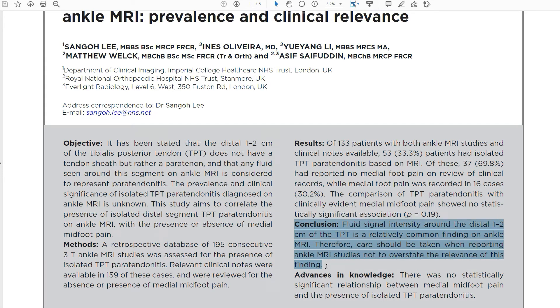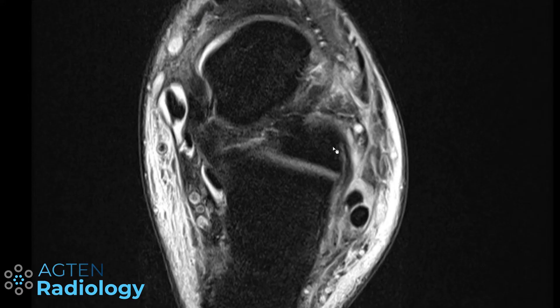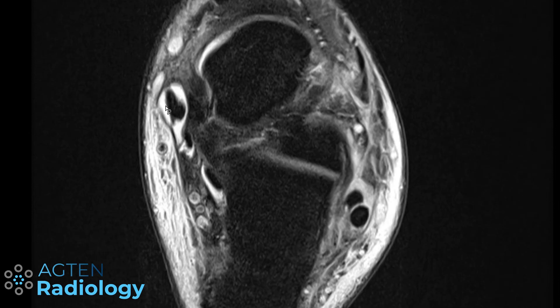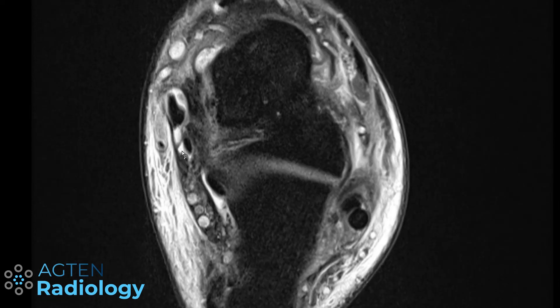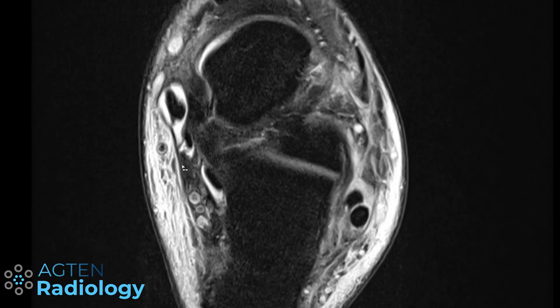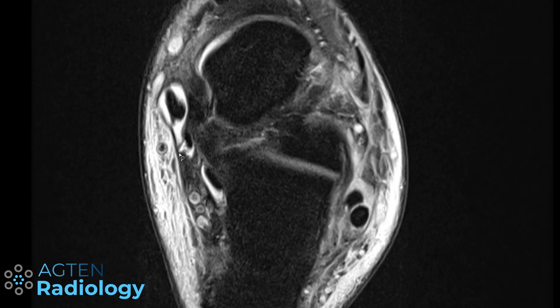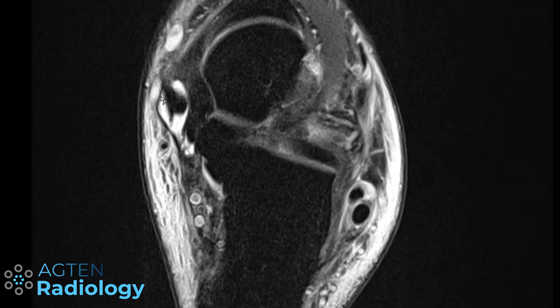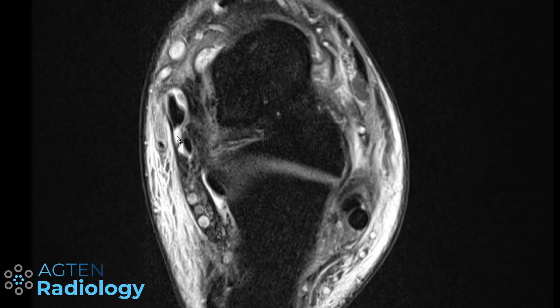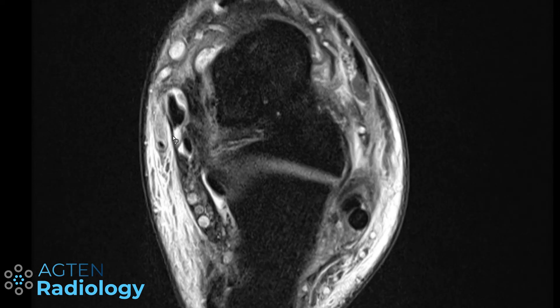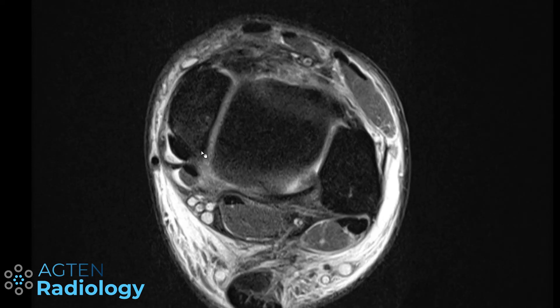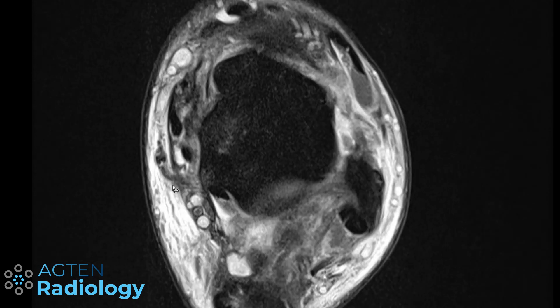This will certainly change my reporting in ankle MRI — I might still call this peritendinitis, but give a disclaimer that it's frequently seen in asymptomatic patients too. I still have to figure out how to handle this, whether symptoms are medially located or not. Also, I think the last word hasn't been spoken yet. Looking at this case, it looks like the tendon sheath might actually be reaching further distally, so maybe there is anatomic variation in how far the tendon sheath reaches. If any anatomists want to assess this, feel free to dissect a few more cadavers to see whether variation exists — that could explain why it's sometimes such a prominent fluid collection.